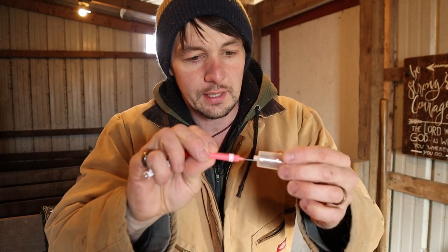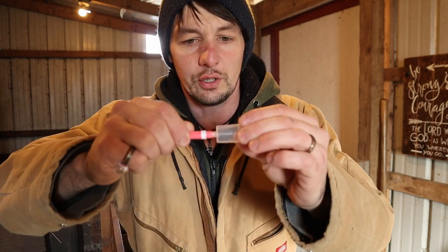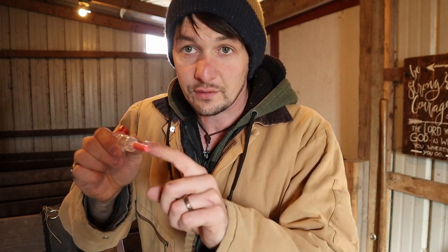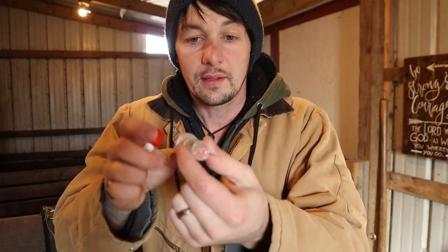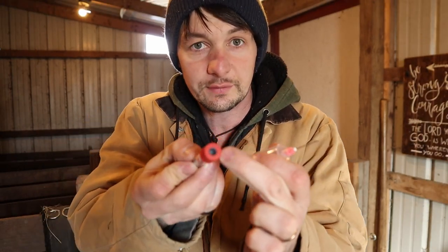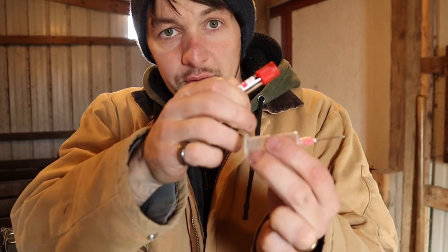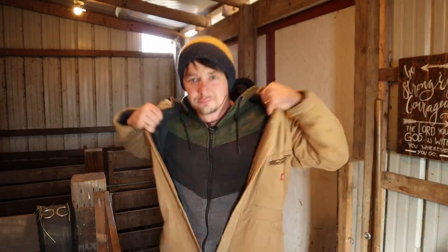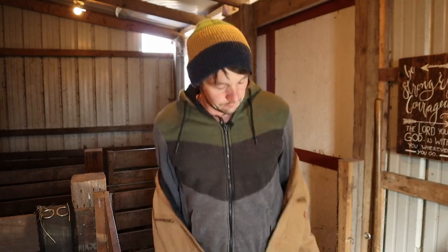Here's what we're going to use: I've got a needle holder, a needle, and a vacuum tube. The needle gets threaded into the needle holder — it has a needle on both sides. When you stick the needle into the vein in the cow's tail, blood starts coming out. We push the vacuum tube onto it; there's a little soft spot that gets poked and it'll suck the blood into the tube to get our sample.